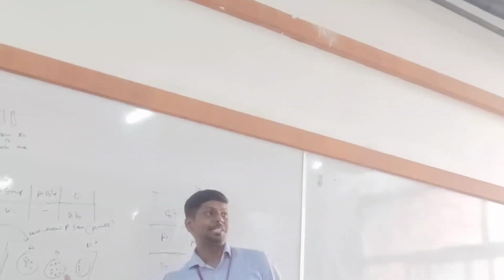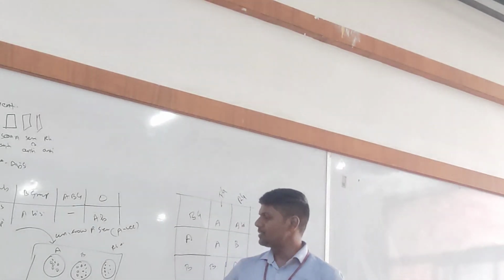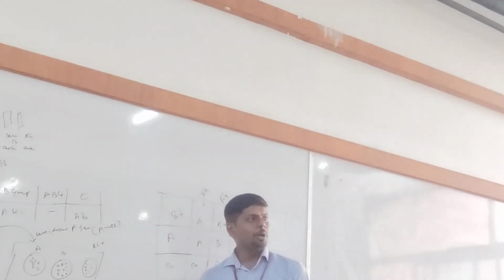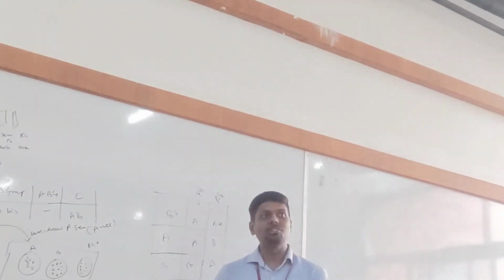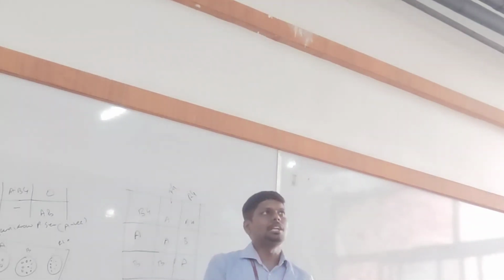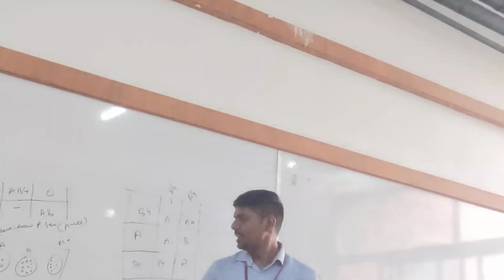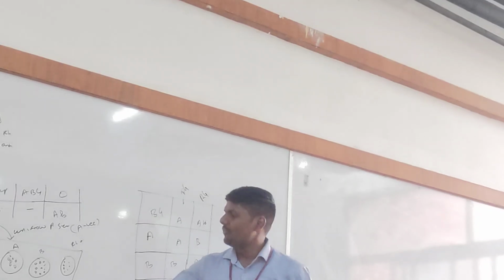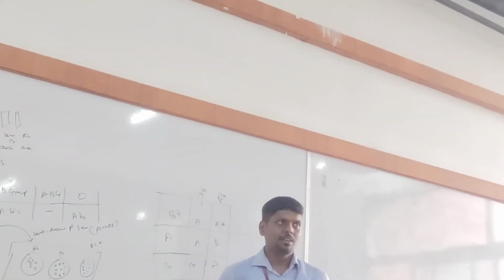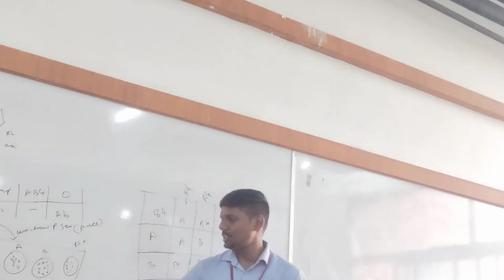Why does he have A antibodies? He might be a B group individual. Got it? Then what is this group? The concept of positive and negative cannot be applicable in reverse grouping. Right? If he is a negative group, that doesn't mean he will have positive antibodies. That's not possible, right? So yes, reverse grouping is only for grouping, not for typing, RH typing. Reverse grouping is only for this, okay? But I will keep RH typing.